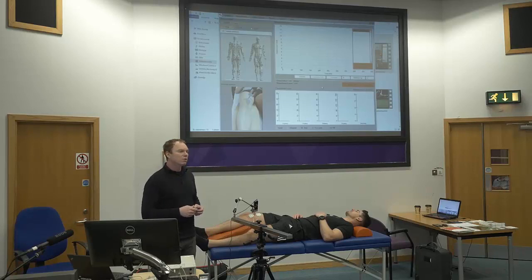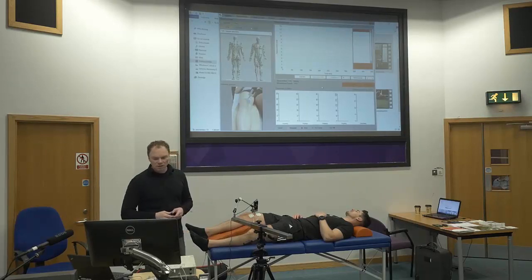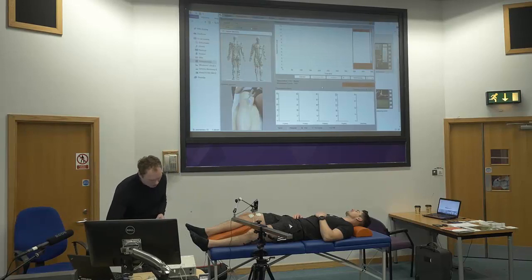Supra-maximum stimulation means I will increase until I get two responses which are exactly the same, even if I increase the current. Let's try it — we'll start with around 20.